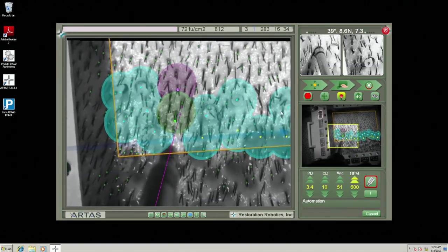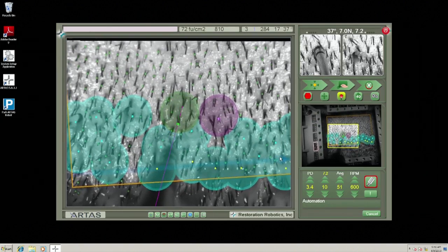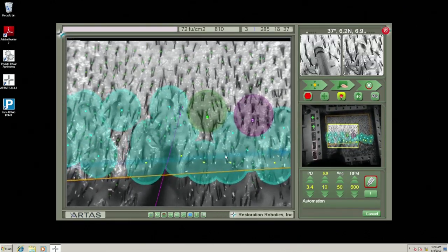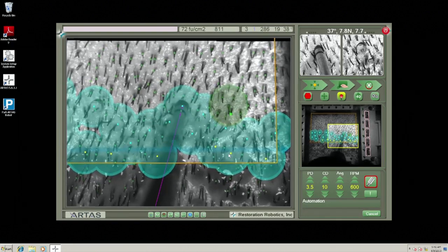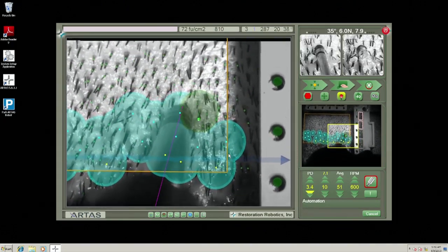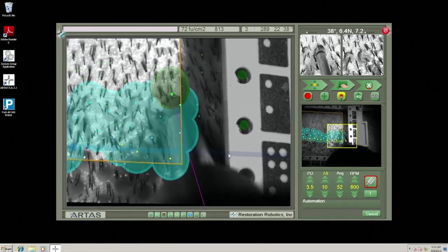So you've got a couple of questions, Dr. Bishara, from some folks in the chat that I was going to pass on for you. Alan has asked, how much tumescence do you inject in a single grid? Right. Well, that number has changed. The amount of tumescence that we inject depends on the laxity of the skin in the donor area. It's a patient-specific phenomenon. As much as we need to, really.